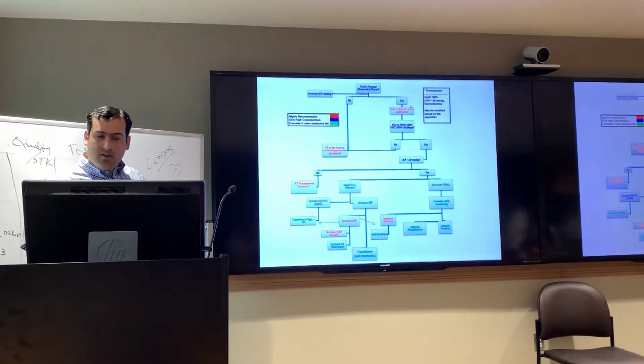The second one is that so you do CT. If the ICP measurement is correlating, wait a couple hours, do FiO2 challenge. Does it go up with 100% oxygen? If it does not, get a CT scan. If it does, your probe is in place and it's working, okay?